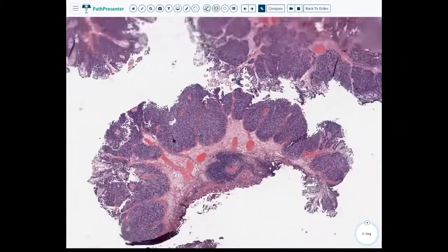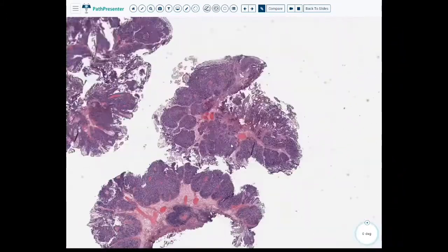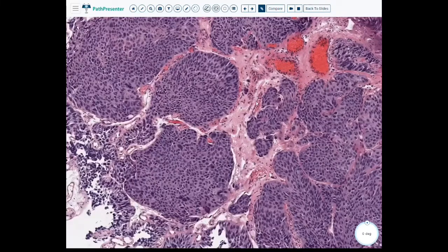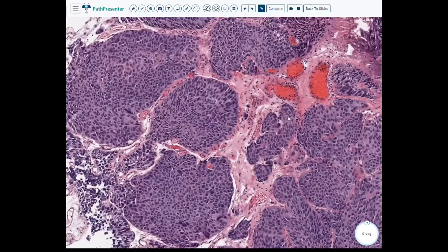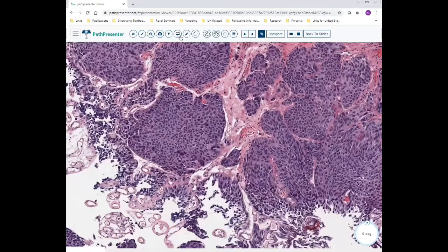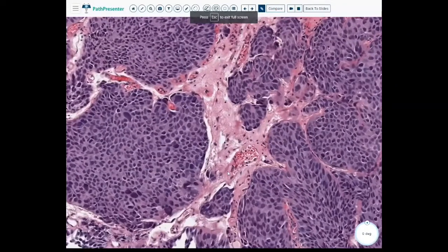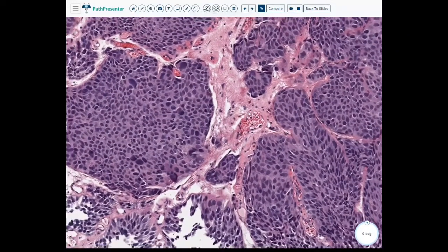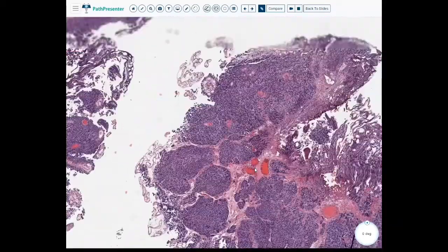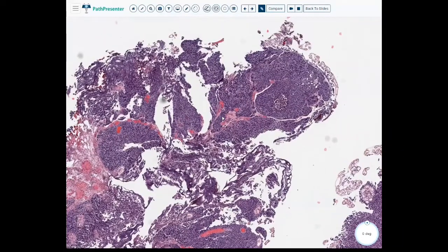I think it's probably going to be borderline. I don't want to spend too much of everyone's time on this. Everything's well-rounded. More crush.